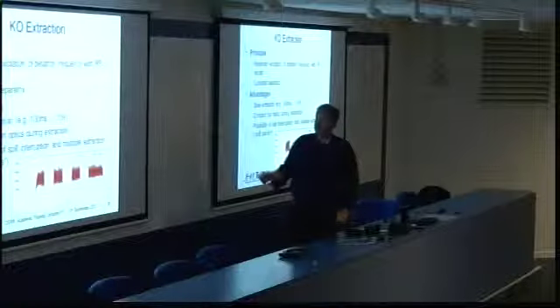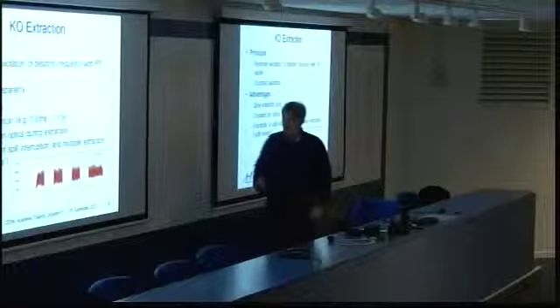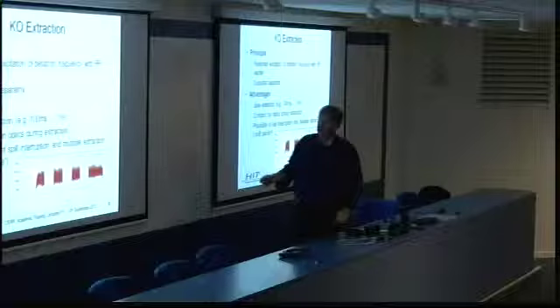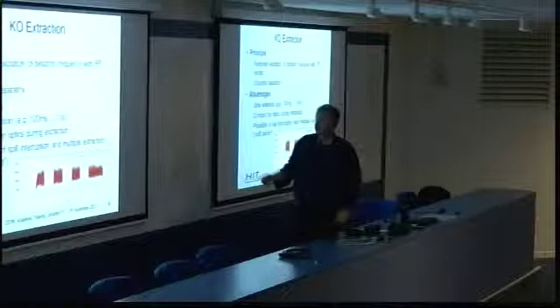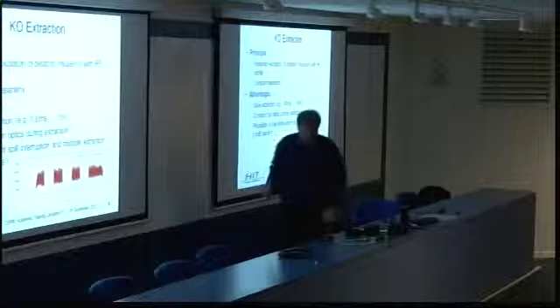As I said, it's a big advantage to have a constant ion optics during the extraction. And what is also possible is to interrupt the extraction process, or spill interruption as we call that, so-called spill pauses. Why do we need that?